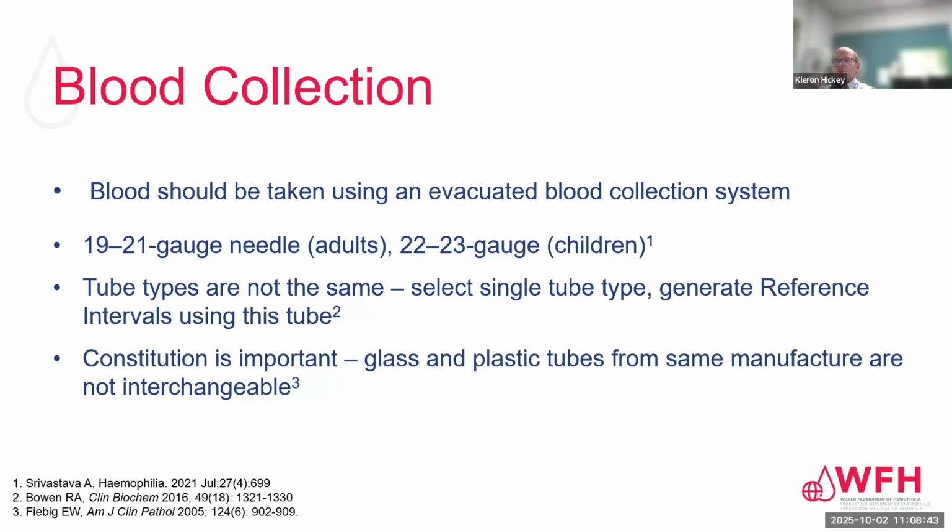And even within the tube type, if the manufacturer offers a glass and a plastic tube, these also aren't interchangeable. So you really should select a tube type that is of one form, let's say plastic, from one manufacturer. And that's the first step in the process of interpreting your lab results successfully.